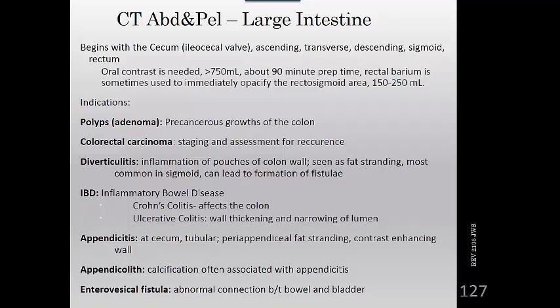There are some indications for scanning the belly for the large intestine. There are polyps, which are adenomas, and those are precancerous growths of the colon. You have colorectal carcinoma, staging and assessment for recurrence of that.